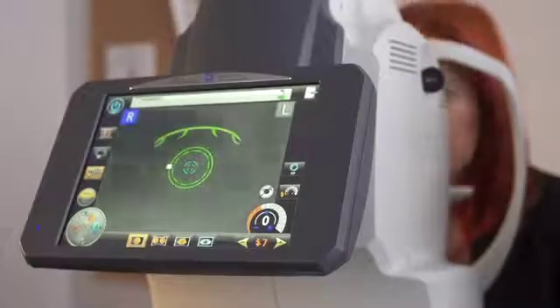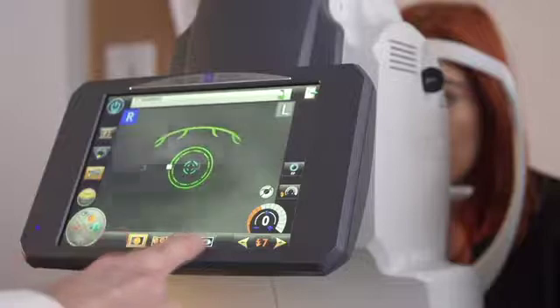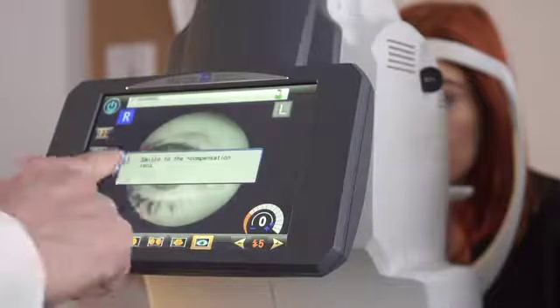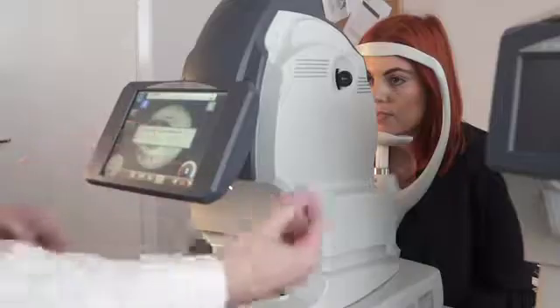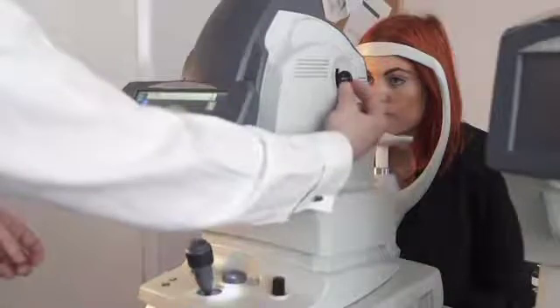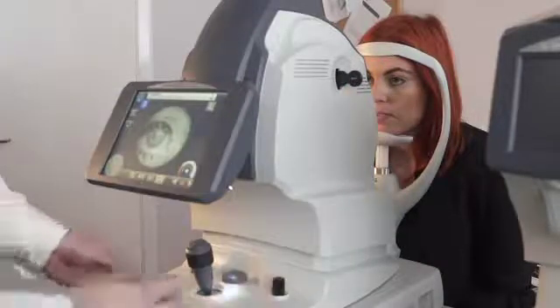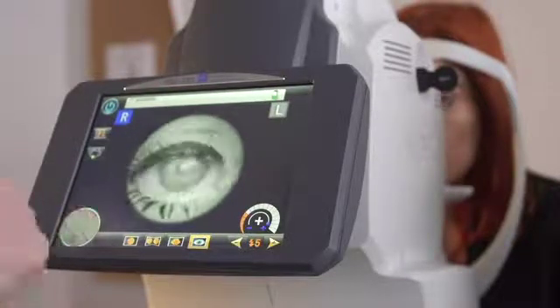So now we are going to take an anterior eye photo. So for this one we press the last icon. On screen it will ask you to add the plus compensation lens, which is this paddle at the side. Just pull it out as far as it will go. In manual mode you can see none of the icons are lit.